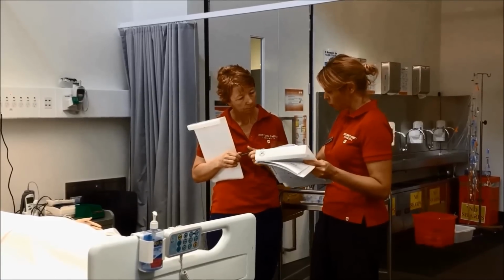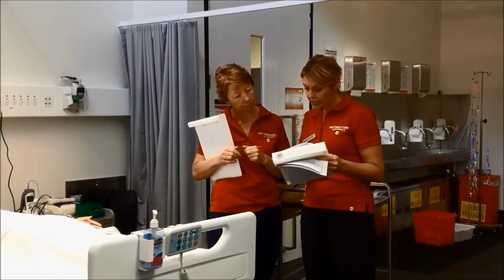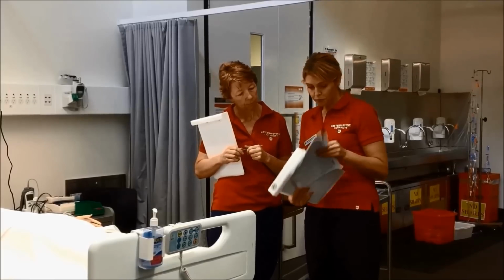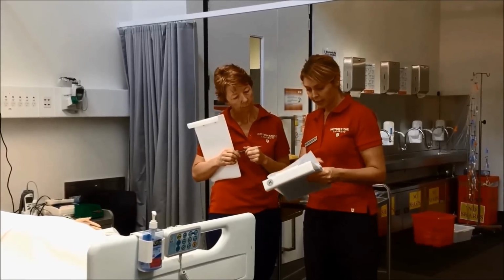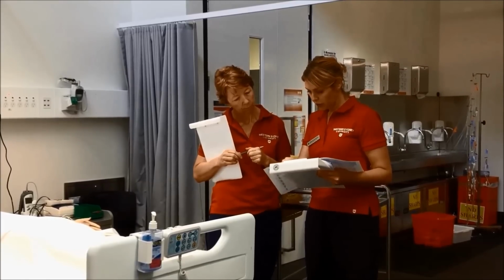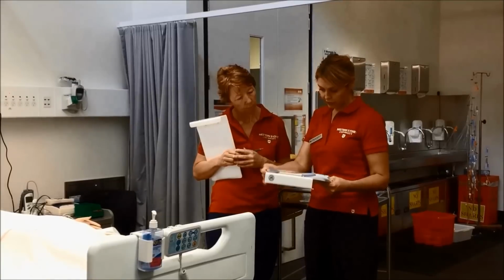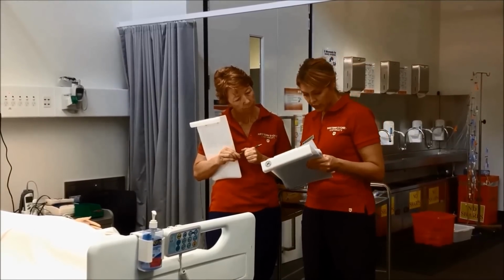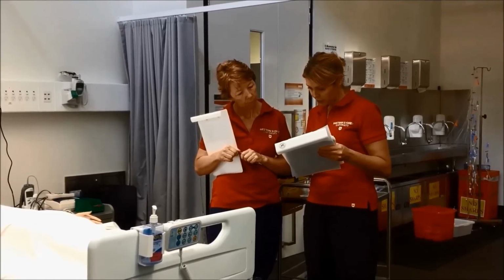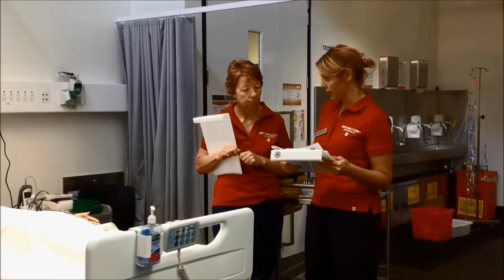So I'm going to check this fluid that's been hung as well as the fluid that I'm going to be giving the patient the antibiotic in. Signed and printed by the doctor, it's legible, it's within 7 days, hasn't been given in its IV. And then I'll just get you to check this gentamicin. I have the same patient, James Lockyer, 1st of 3rd, 45, same MRN, which I've checked with the patient, and he has no known allergies. I'm going to give him a stat dose, which means now, of gentamicin, today's date, IV, 80 milligrams right now. Doctor's signed and printed, and it's all legible. Hasn't been given, and it's within 7 days. You happy with that? Thank you.